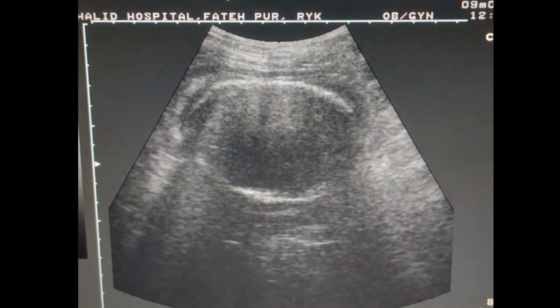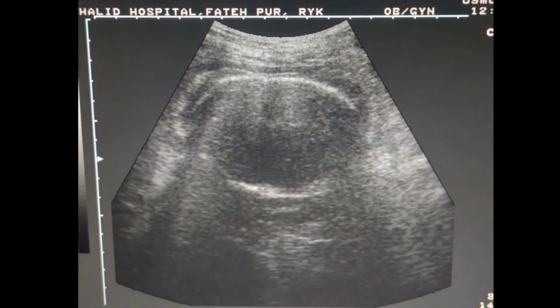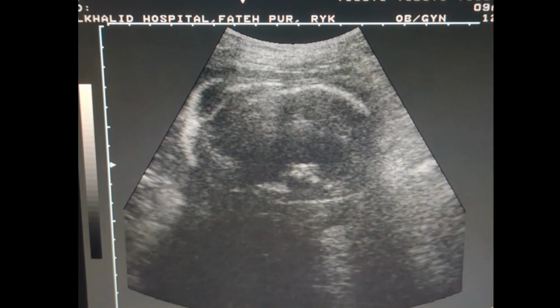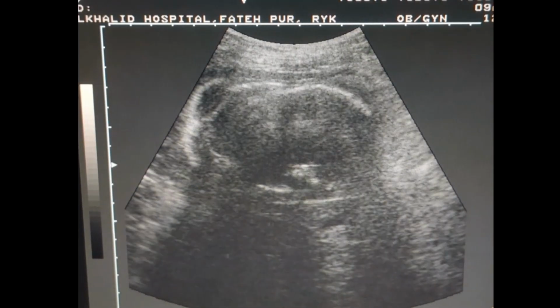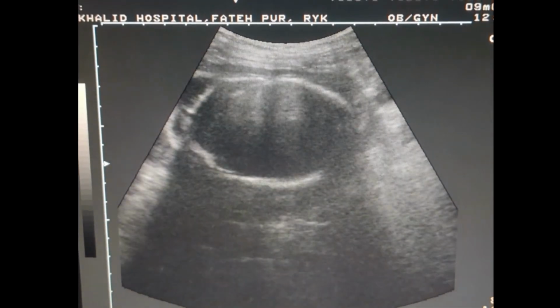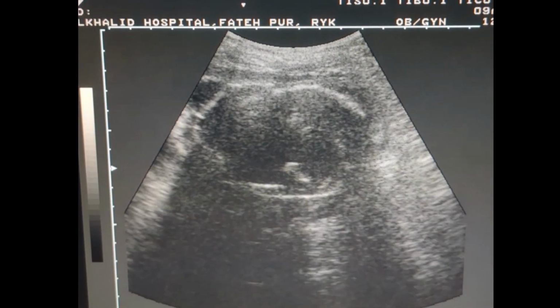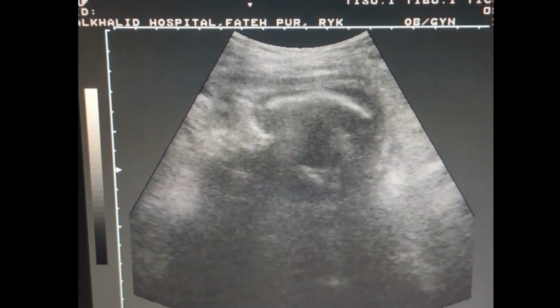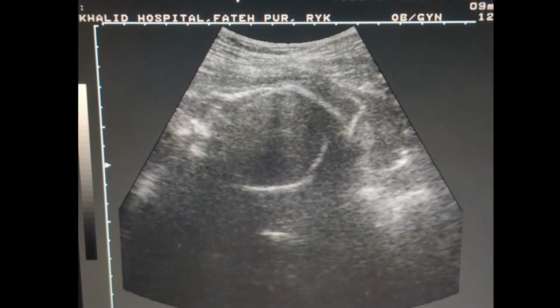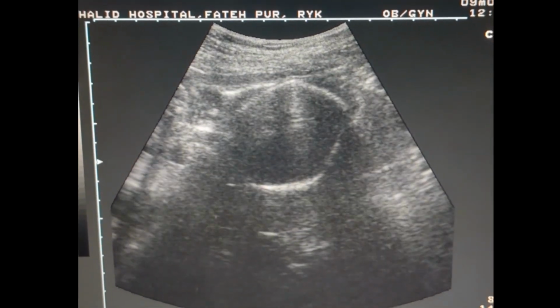This is a video of fetal intrauterine death at 28 weeks. This is the fetal head. The submerged fetal head bones, called Spalding sign, is clear in this view. Spalding sign means the collapse of fetal skull bones. We can measure biparietal diameter and head circumference.